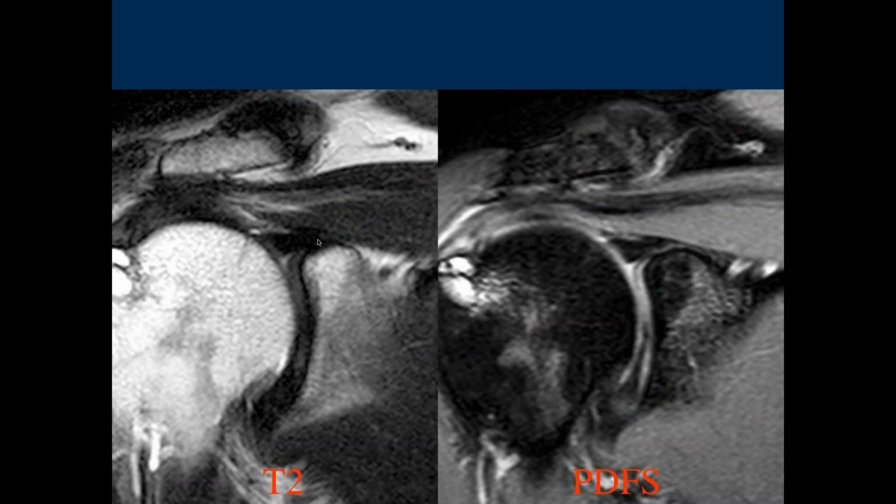This is the biceps anchor coming in here, which we can see there. Here we can see part of the articular cartilage. And then right in here, what we can see, this is the labrum. That's the biceps anchor. We can see a little bit of fluid extending deep to the labrum.